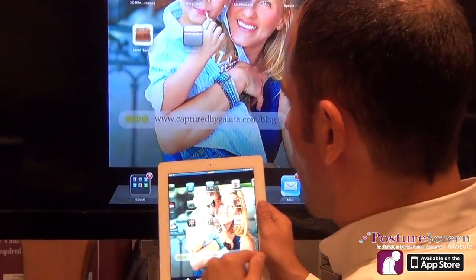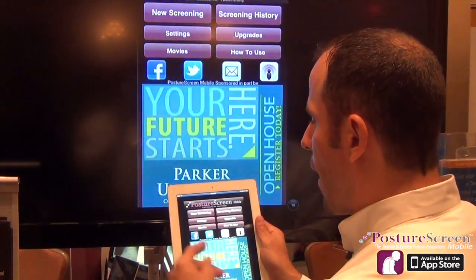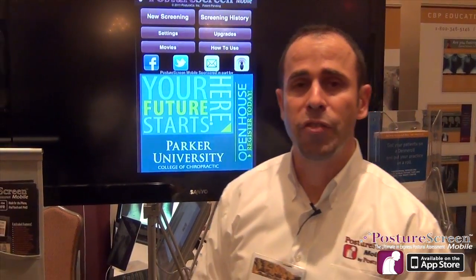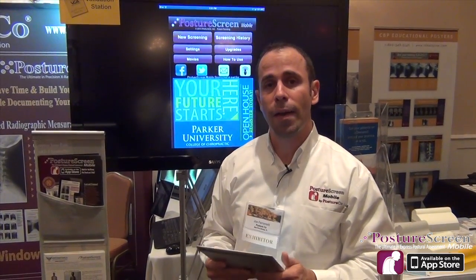So we've got all the apps right there, and if I want to, I can go ahead and start my app up this way, and browse through and actually do a spinal screening in real time. For more information on how to use the AirPlay functionality built into iOS 5, visit apple.com, or come to our website at postureanalysis.com.